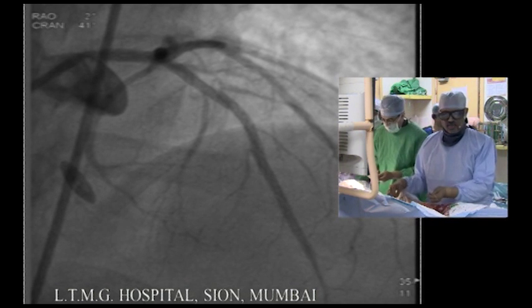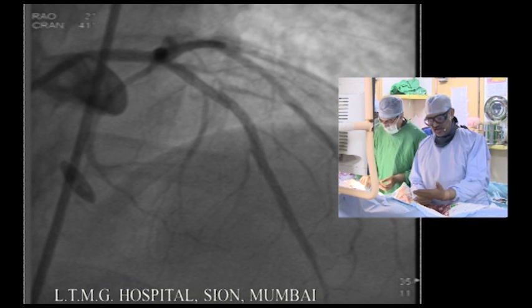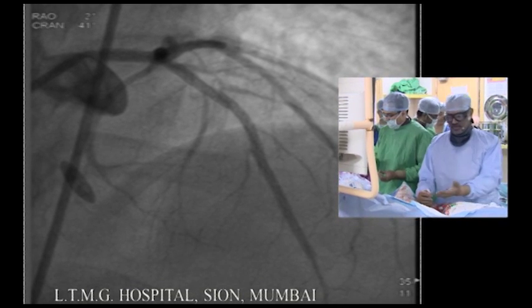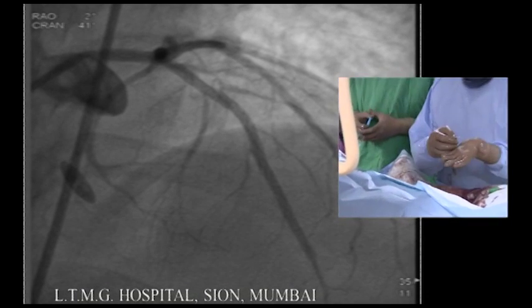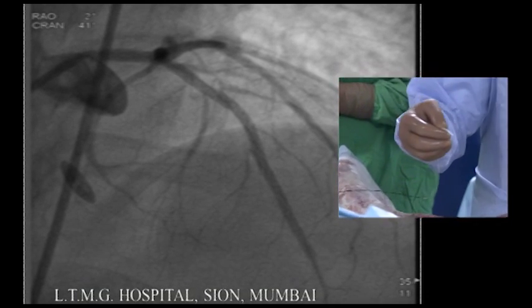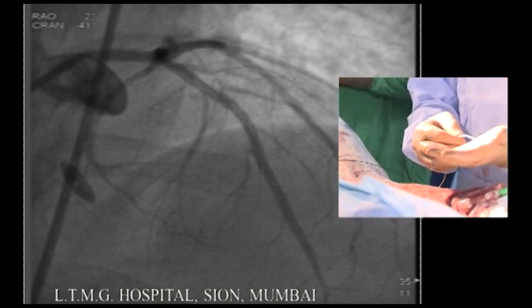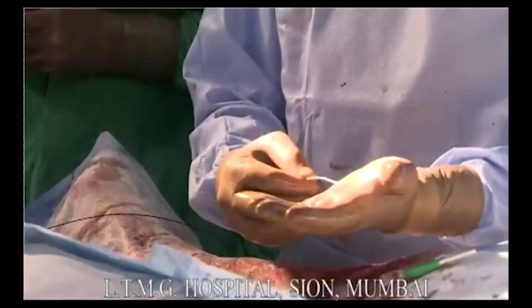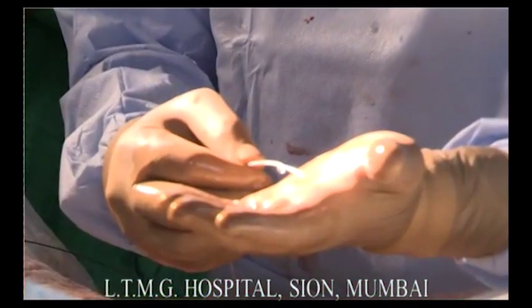How about you? In my center, the usage is about 25%, but now IVUS is mandatory, before and post-stent. Even before. But we should generally agree that if you are using IVUS and you incur an extra cost, it's better to use it before and after. Right. So when you're using it, obviously everybody recommends to use it before and after because you're not increasing the cost of the device.